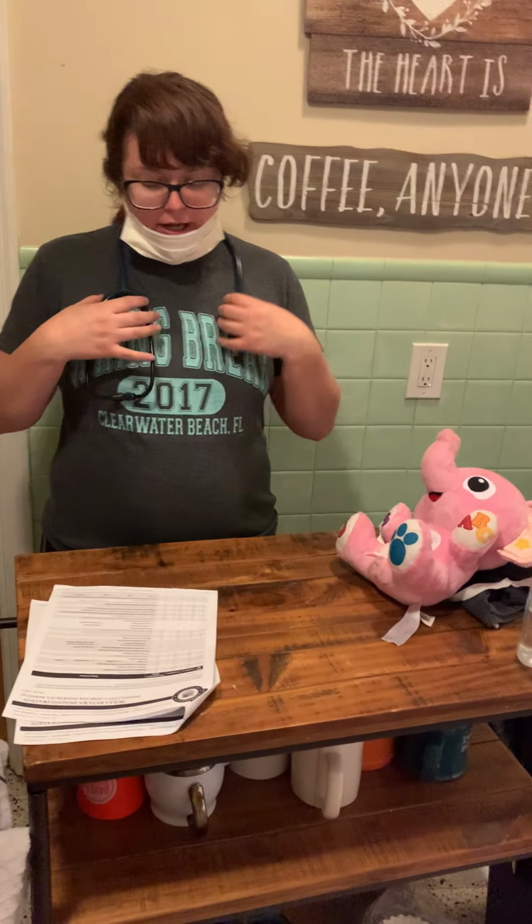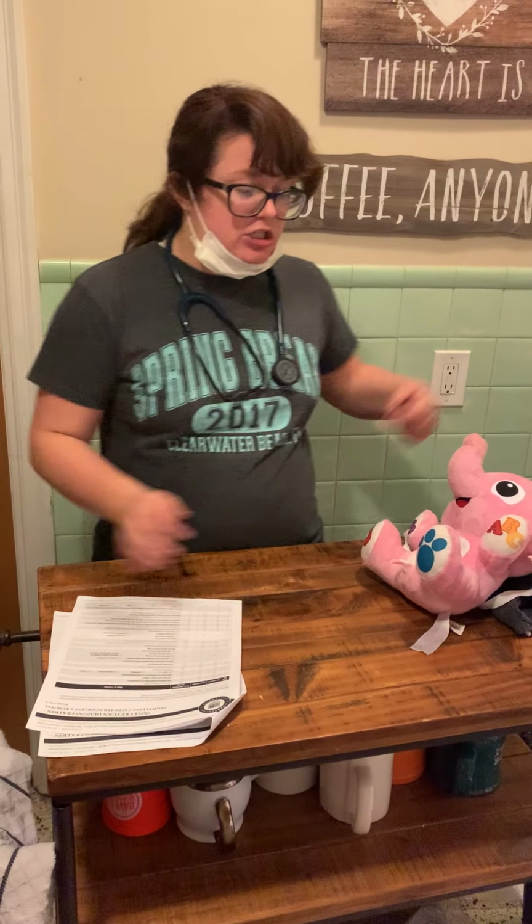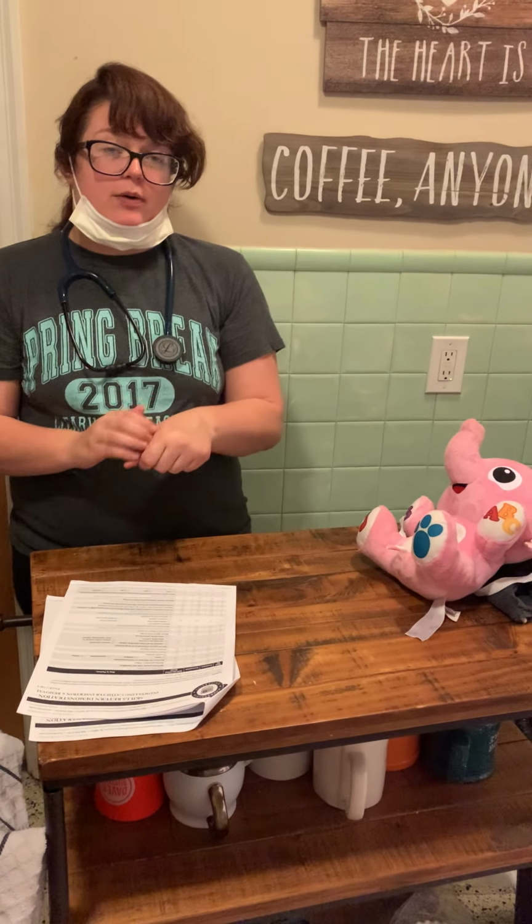I have identified them and confirmed on the computer that I have the correct orders for this patient. Then I'm going to perform hand hygiene, and I'm going to explain the rationale of what we're doing today.